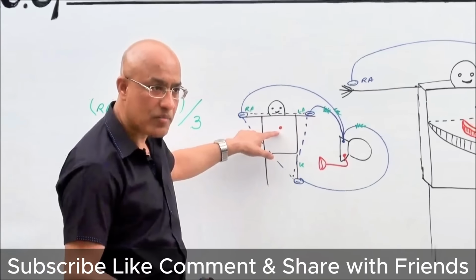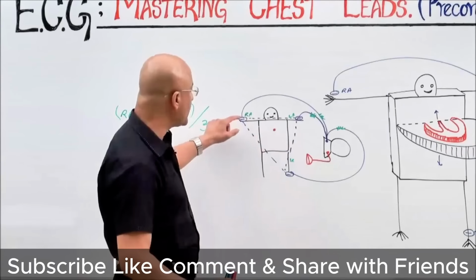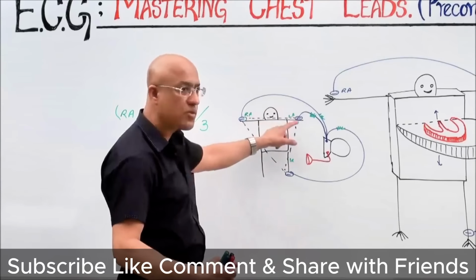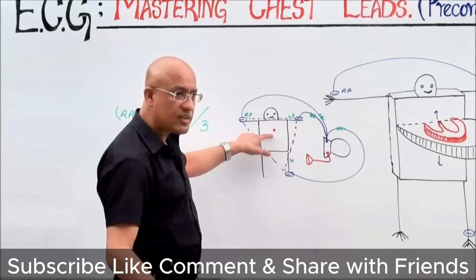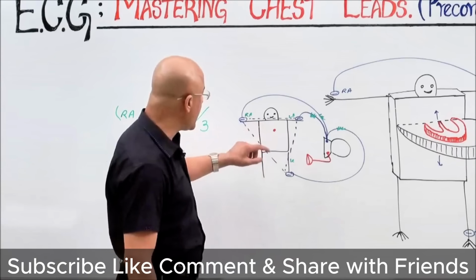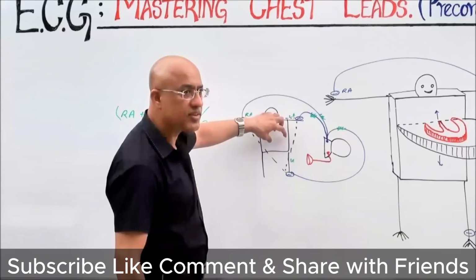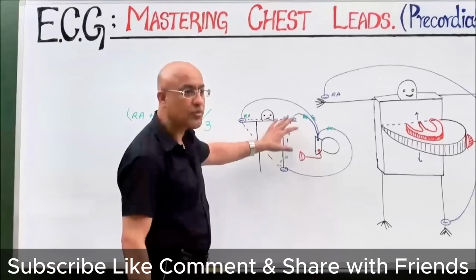Is that right? By mathematical calculation, when the same potential is present, either positive or negative, it doesn't matter, at the angles of an equilateral triangle, then the potential at the center of the triangle is 0, right? Because it is not a perfect equilateral triangle, and the heart is not in a perfectly central position, a little bit of current flow may be there.